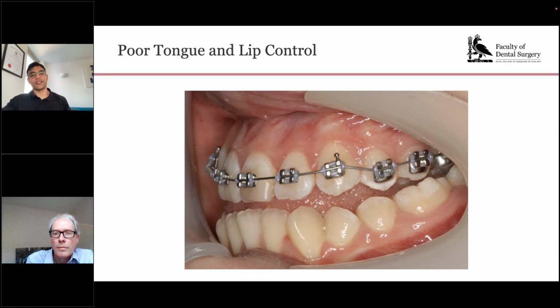And if you're just getting into it, and if, for example, cost is a barrier to entry, right? If you think, well, there's a lot of money to spend, buying a twin flash and the latest mirrorless camera will cost you a fortune, and getting a far cheaper camera body, a good lens and a good ring flash will be far cheaper and will get you about 95% of the way there.